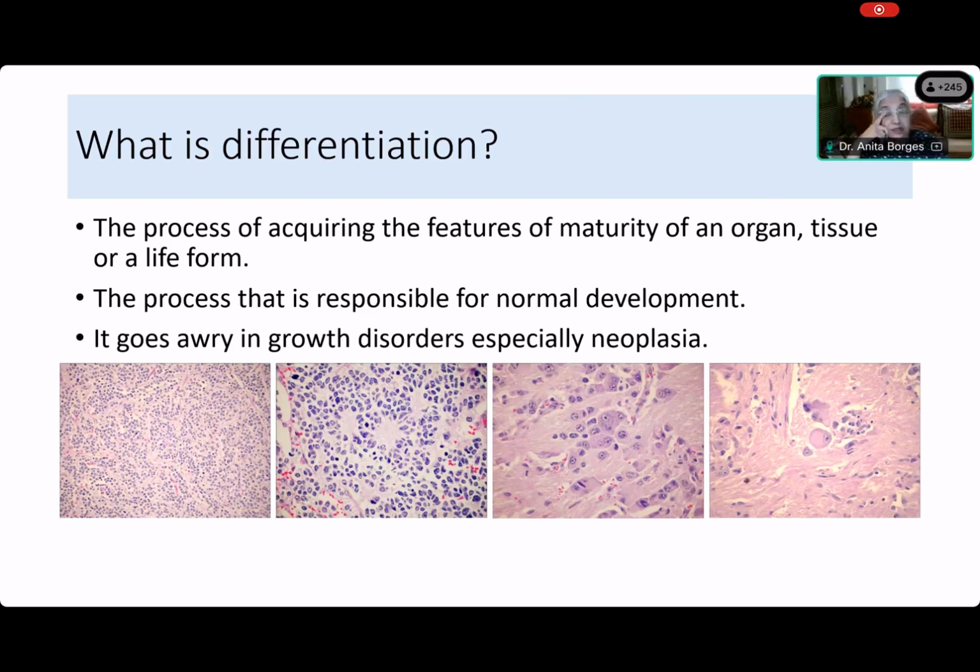Everybody agrees with Lalit? Navneet, do you agree with Lalit? Ma'am, we cannot see any specific pattern formation here. Can't see specific pattern formation. Now remember, the first picture is just small round cells. The next picture has got rosettes with neuropil. And let's go, if possible, to the last picture. What do you see in the last picture? And then we'll talk about the third picture. Go on, what do you see in the last picture, Navneet? Ma'am, all cells are of different size and have nuclear pleomorphism.